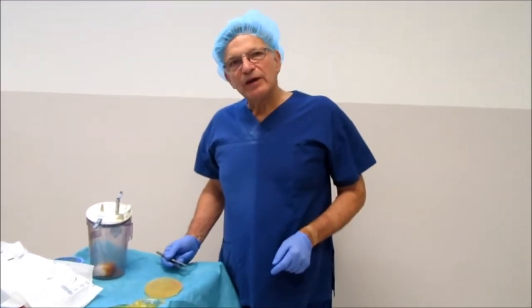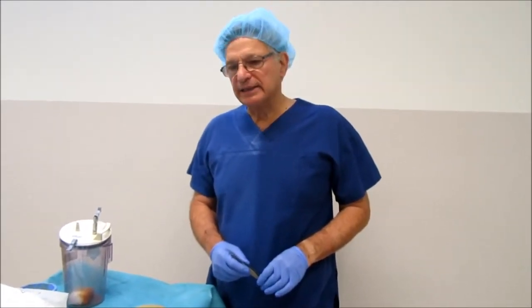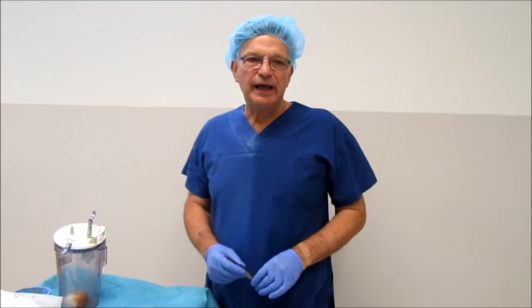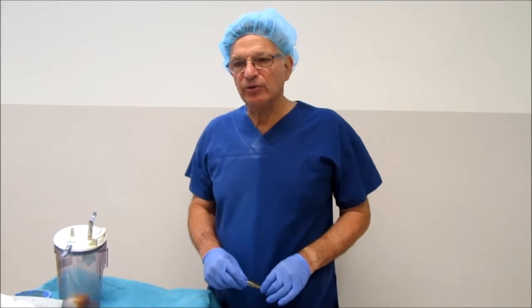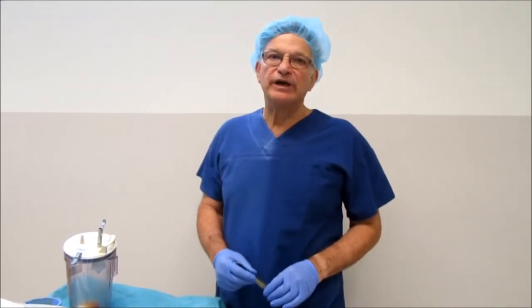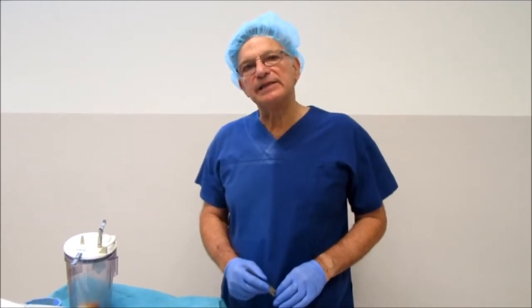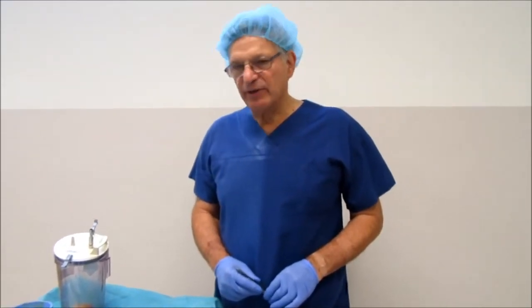Hi there. One of the common operations that plastic surgeons do these days is removal of old silicone implants. This morning I operated on a lady who had her implants inserted 13 years ago. They served her well, but in recent years she had a lot of pain in her breasts, many symptoms of breast implant illness, muscle aches and pains, fatigue, and hair loss. Interestingly, when we removed the implants, we found that one had ruptured and the other was still intact.